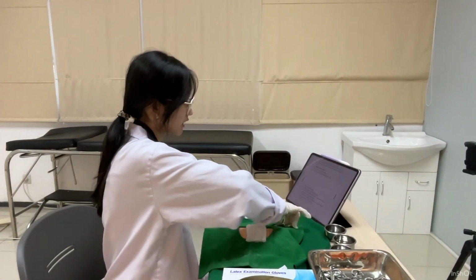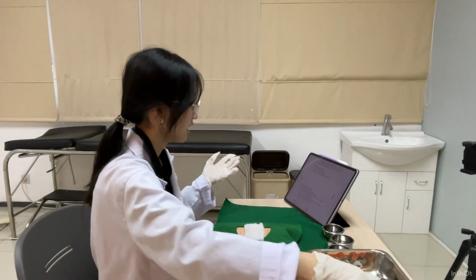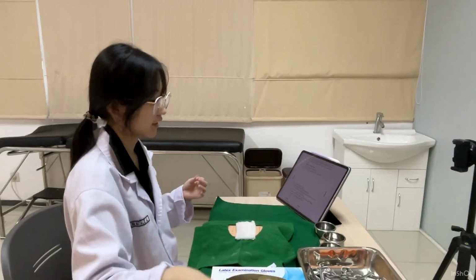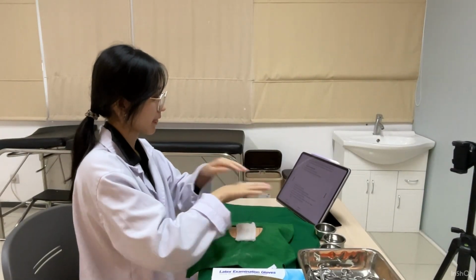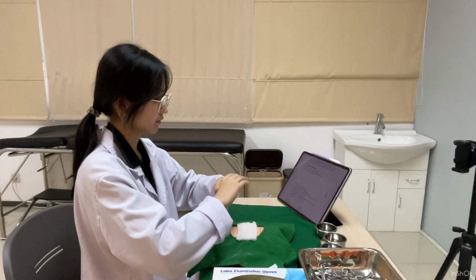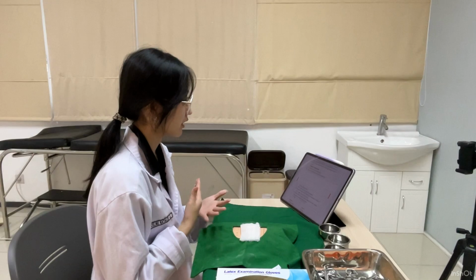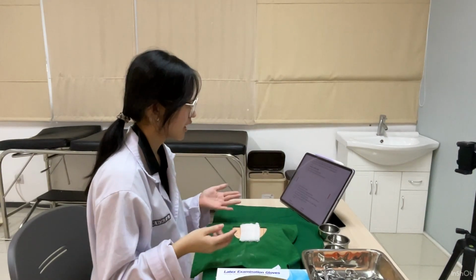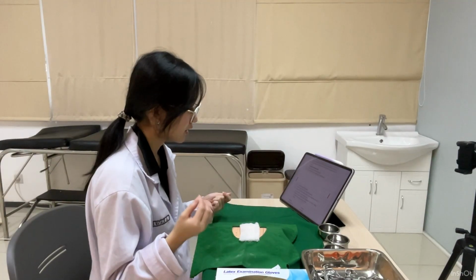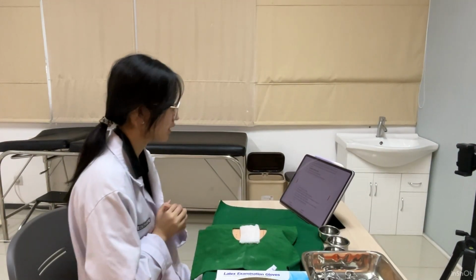Okay, so next I will clean all the tools and the materials and put them in a waste container. And I will remove my gloves and conduct 6 steps hand washing. And I will record into your medical record the location of your wound, the type of your wound, the type of action like the number of sutures I used, and the type of suture, which is the catgut 3.0, and also educate you.